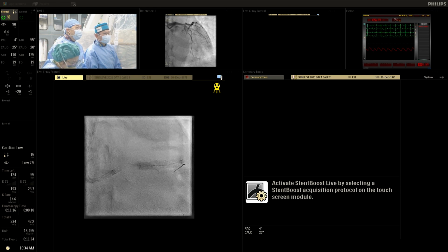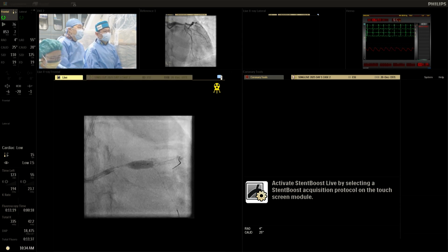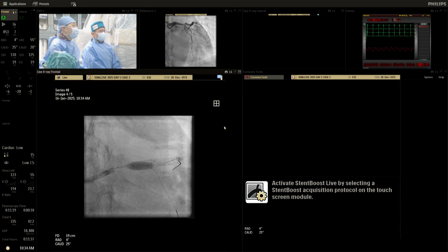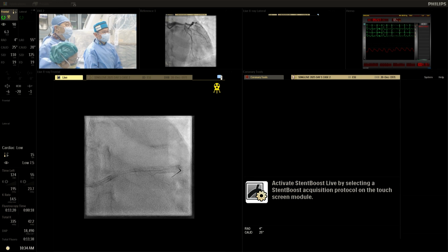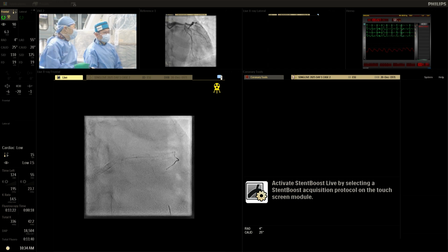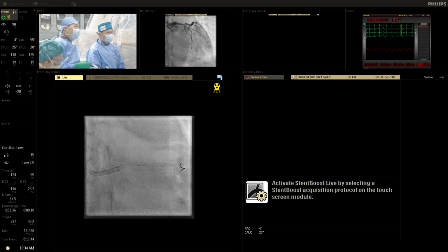Okay, here. This is where the carina is. So the side branch actually gives a very good idea where the carina is. Just let the balloon come down. Do you think it is useful to use a 4.5 to dilate that under-expanded part? You think it will help?